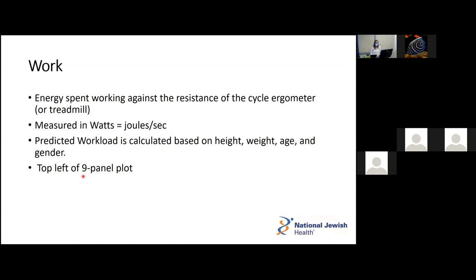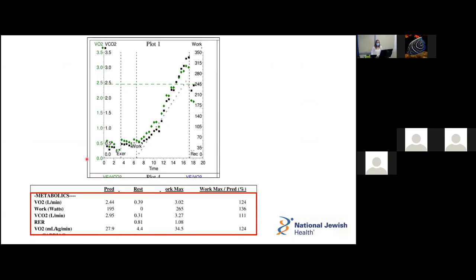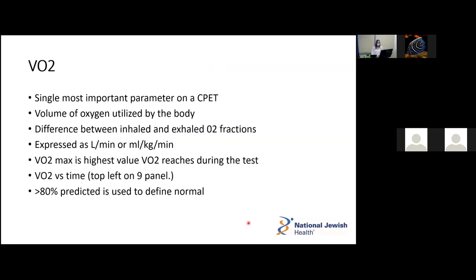Work is essentially the energy the patient spends working against the resistance of the cycle ergometer or treadmill, measured in watts. The predicted workload is calculated based on the patient's height, weight, age, and gender, and is found on the upper left panel of the nine-panel plot. In this sample patient, his predicted work was 195 watts and at maximum exercise he hit 265 watts — achieving 136% of his predicted workload. So based on this alone, he did give a maximal effort.